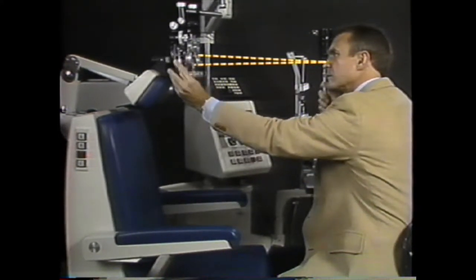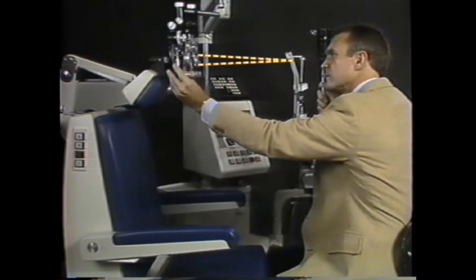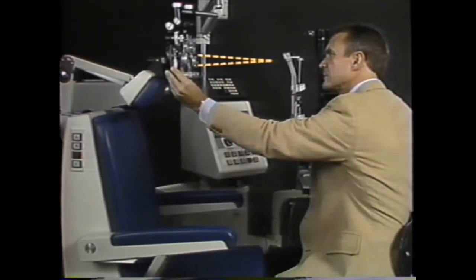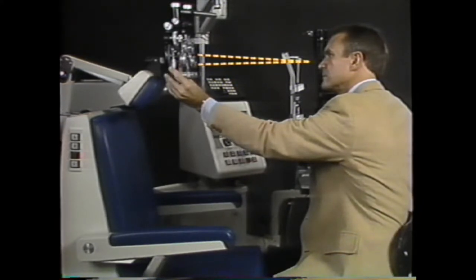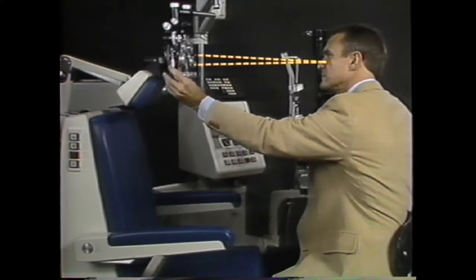Adding plus lens power — dialing down on the phoropter — pulls the far point toward the eye. Going in the minus direction — dialing up on the phoropter — moves the far point away from the eye.